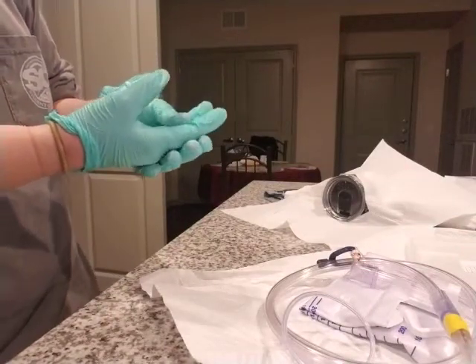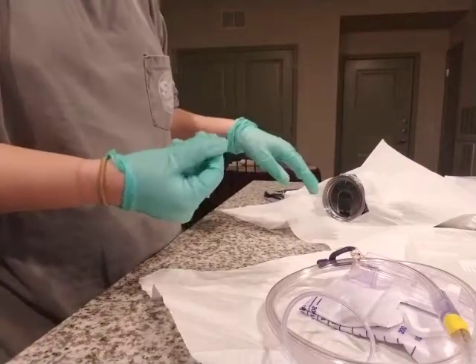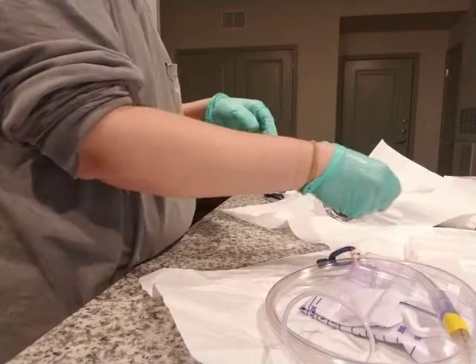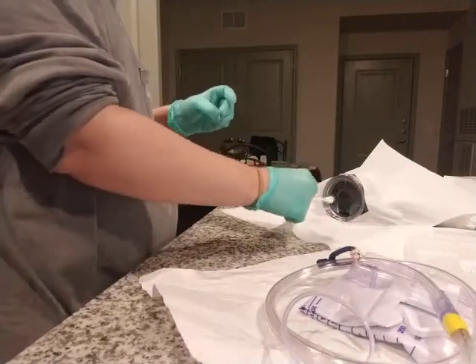Now I'm going to clean the urethral meatus with my antiseptic swabs in a circular motion.